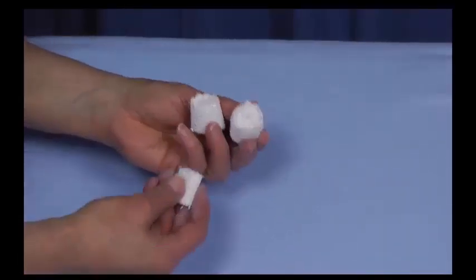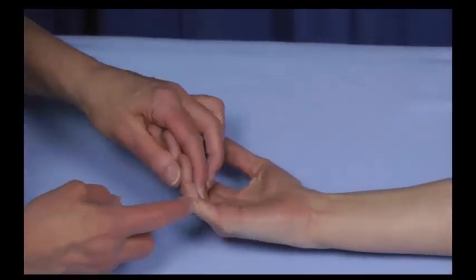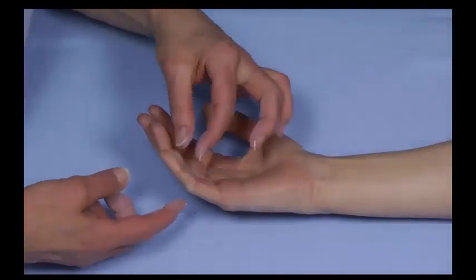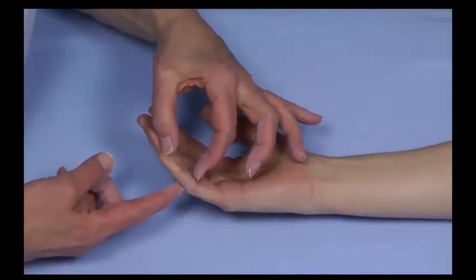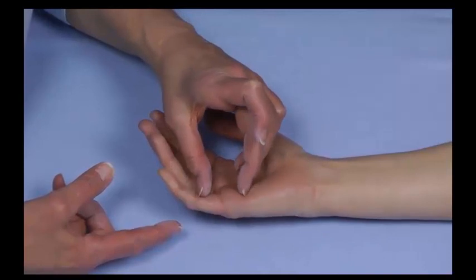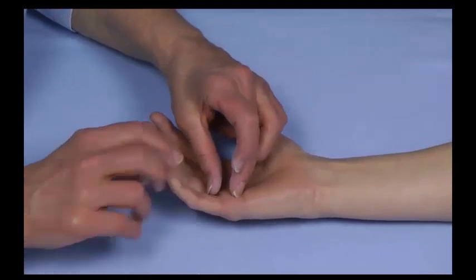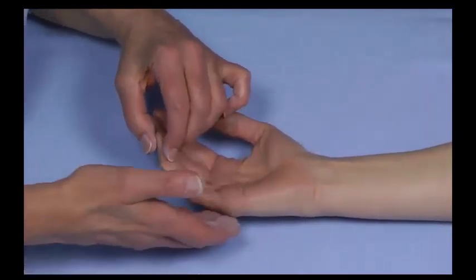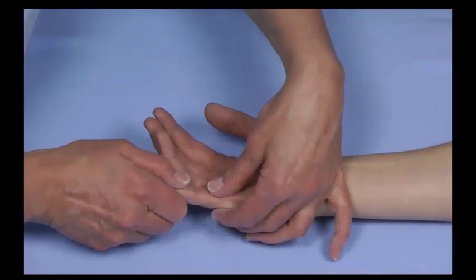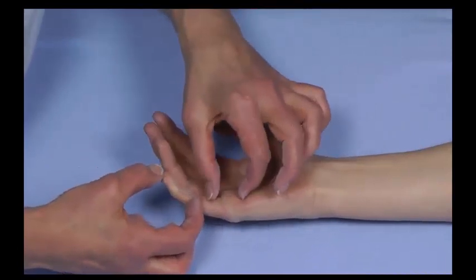Imagine she has a flexion contracture of the PIP joint of the little finger, which is often very short. We're going to put plaster of Paris from the PIP joint distally and let that harden. Then plaster of Paris from the PIP joint proximally to the distal palm and let that harden. Once both are firm, we wrap around with the usual serial cast configuration, holding proximally and distally to precisely position the PIP joint with longer lever arms.